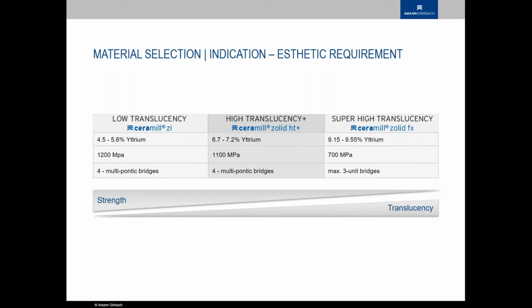I'm no expert, I'm no engineer, but the way I've had it explained is that you have a monoclinic, tetragonal and a cubic phase in the zirconia. During sintering it goes from the monoclinic into the tetragonal phase, and then eventually into the cubic phase, where, if the yttrium amount is high enough, it might stay. So if, over long-term aging, something in the cubic zirconia were responsible for changing the phase, it would then be in the tetragonal phase and not the monoclinic phase.